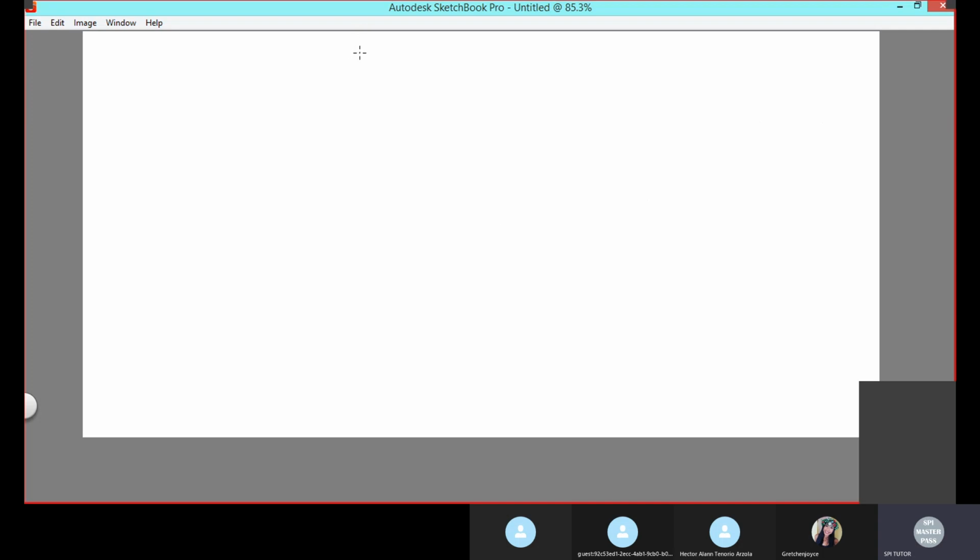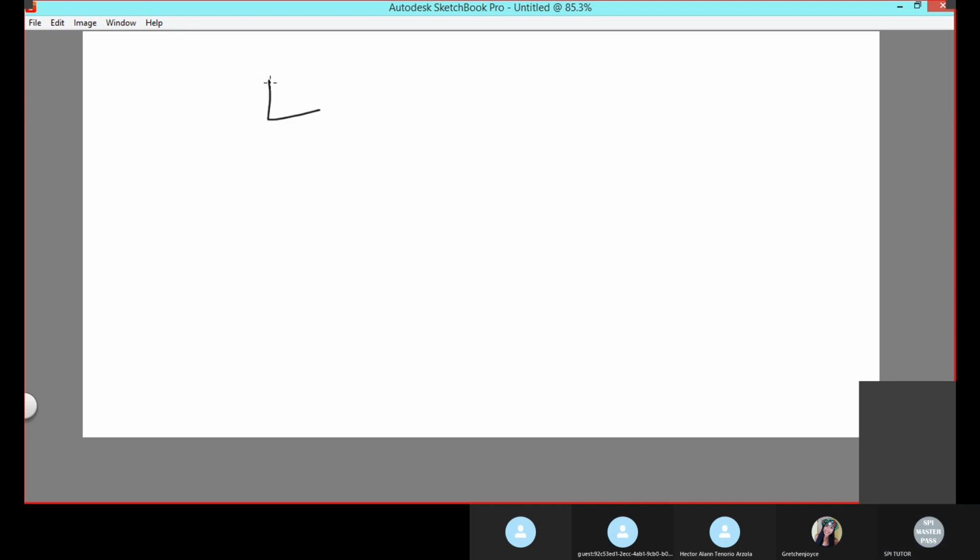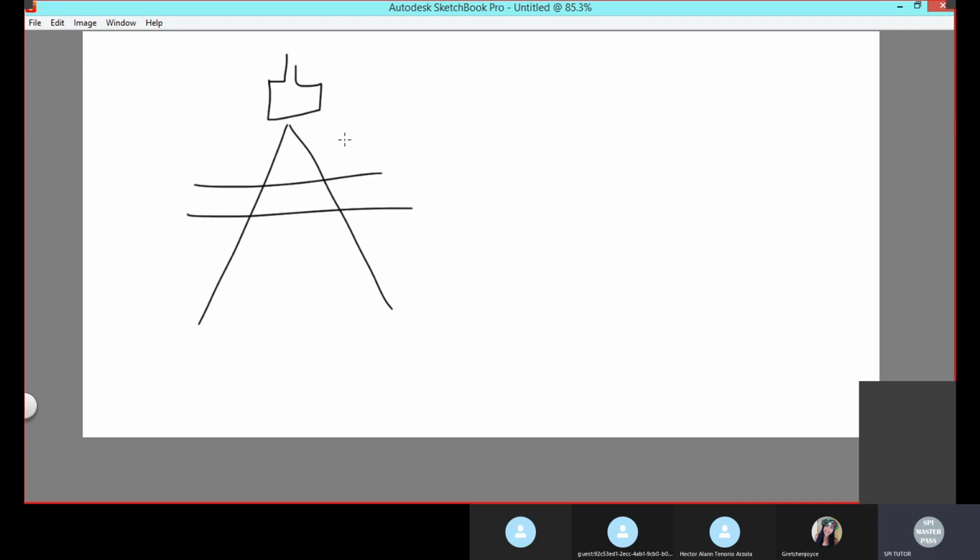The next step is predicting flow. Okay. If I have a transducer here and a vessel is like this, if blood is moving like this, it's very easy to imagine, oh yeah, the blood is moving towards me. Or if blood is moving like this, it's very easy to imagine the blood is moving away from me. Okay, so in this case, not a problem. But what happens if your vessel is like this? Then what?